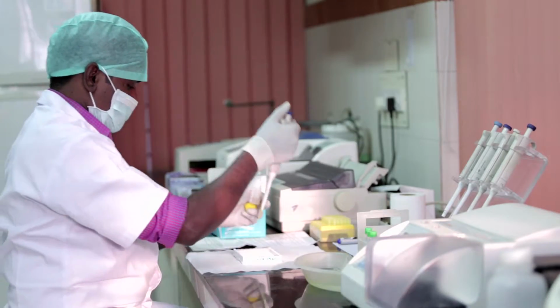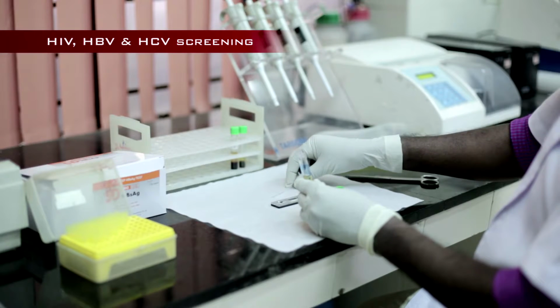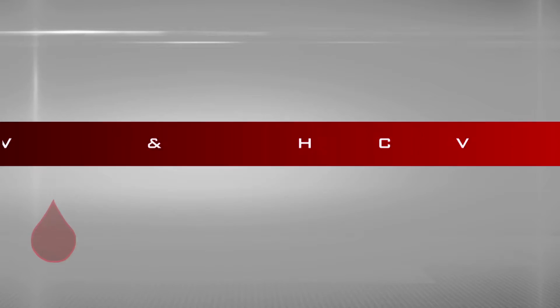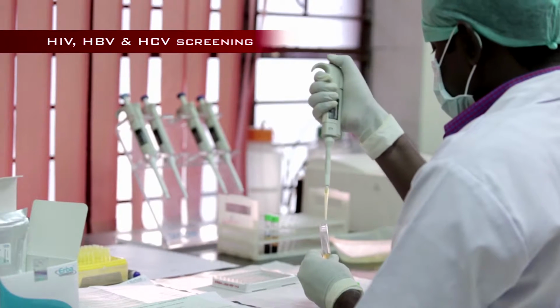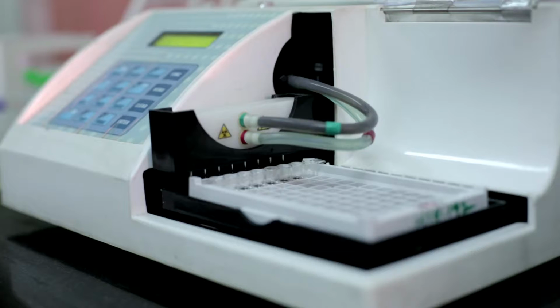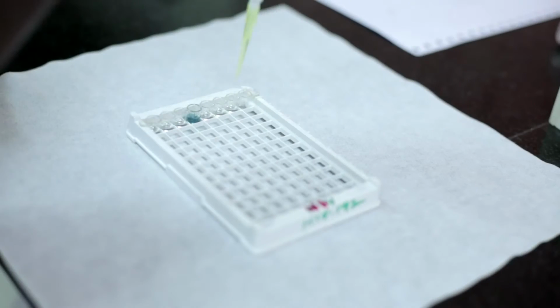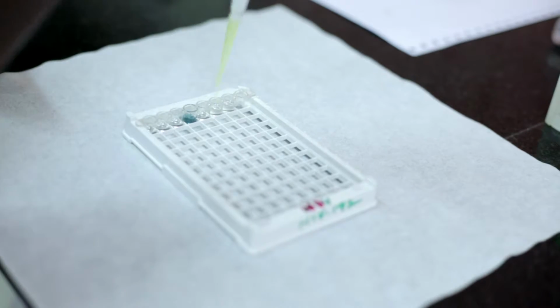This video describes the ELISA and rapid testing methods for HIV, HBV and HCV screening, smear tests for malaria screening, RPR test for syphilis screening. HIV, HBV and HCV screening: HIV, HBV and HCV are routinely screened by ELISA tests which detect anti-HIV antibodies, HBV surface antigen and anti-HCV antibodies.